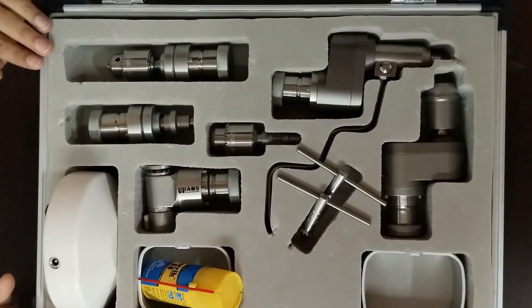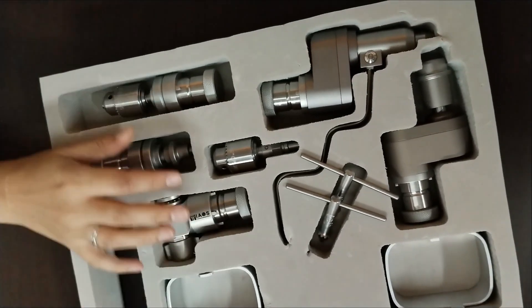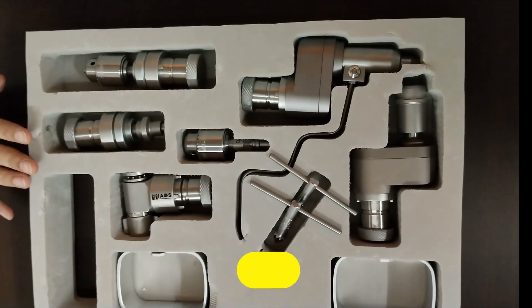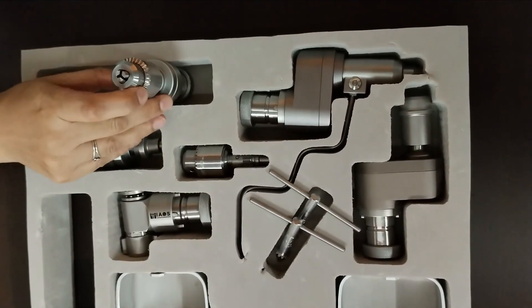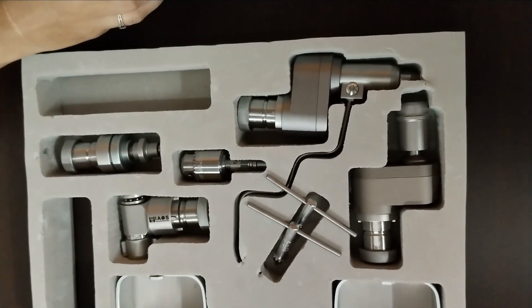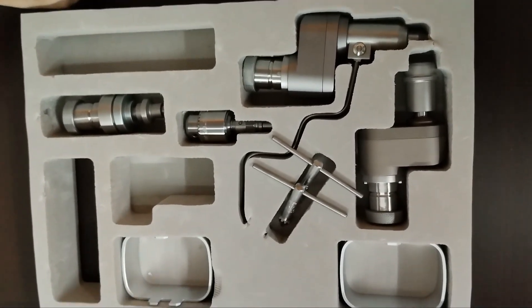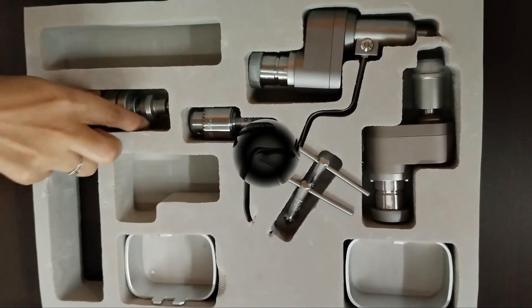This is what this box consists of. This power tool comes with interchangeable attachments, making it suitable for a wide variety of orthopedic procedures. Whether you are performing bone resection or osteotomy, this power tool ensures precise and efficient results, minimizing trauma to the patient.